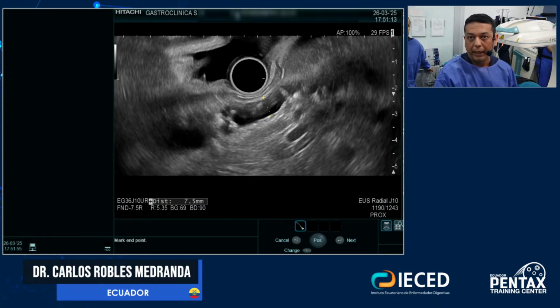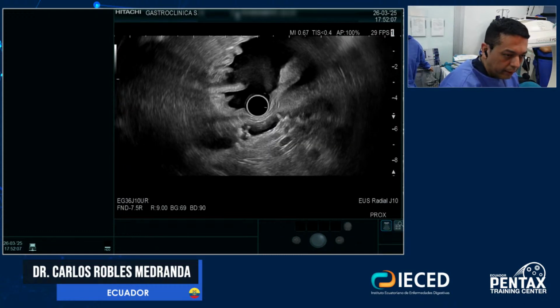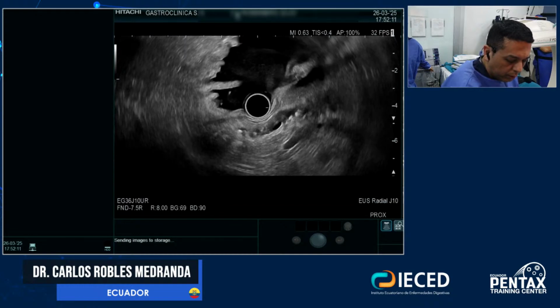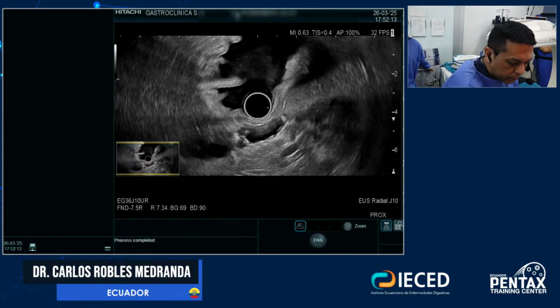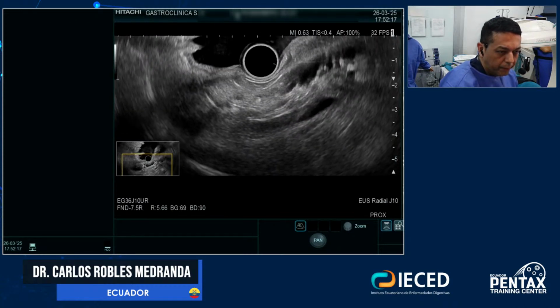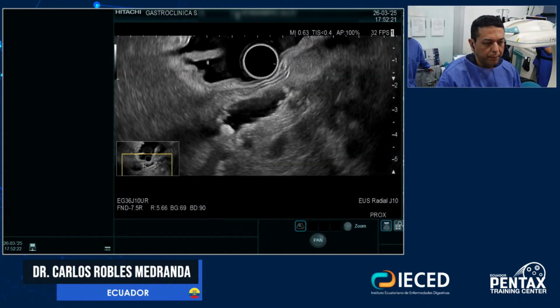This patient doesn't have pain. To be honest, there are not too many symptoms in this patient, and it's because of the MRI and the elevation that I sent this patient to perform MRI, and now I am evaluating because of the results of the MRI.